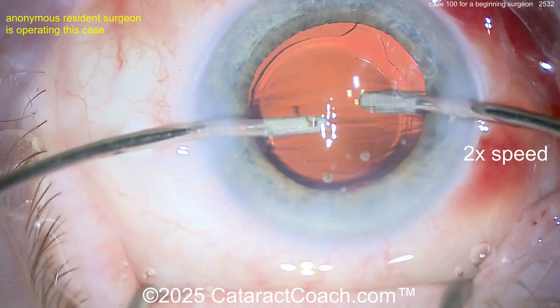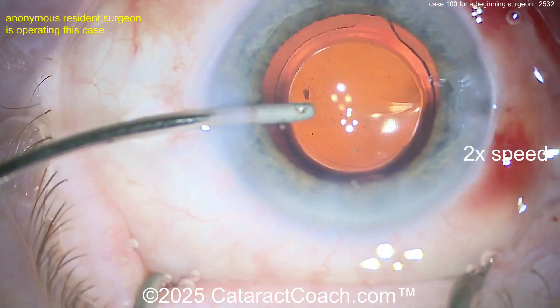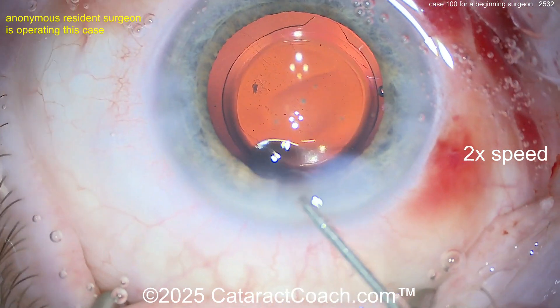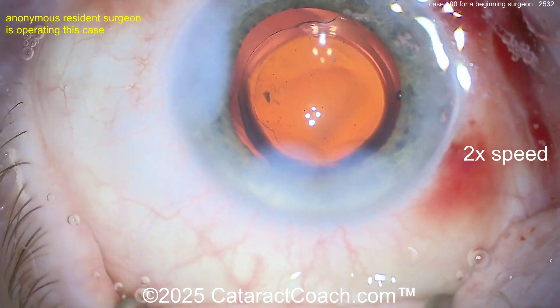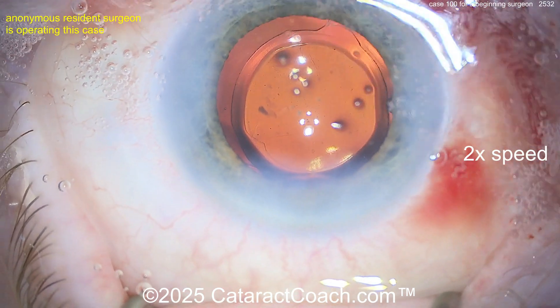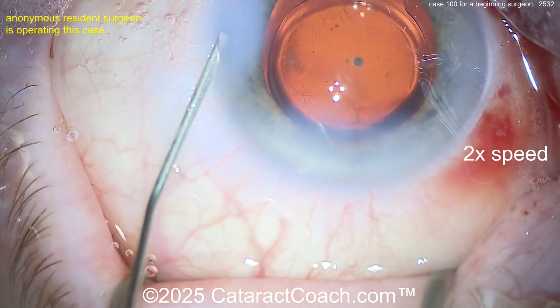You're a little bit afraid of going behind the optic when starting out, but you have to learn how to go behind the optic and remove viscoelastic — that's important. Put that on your list of things to learn. Now the end of the case, coming out of the eye, sealing up the incisions — a little bit of stromal hydration on the roof of the incision, that's not too bad. Sealing up the paracenteses — I think that's a bit much. Check all the incisions. I commend you — you did a good job, you're learning a lot. Keep up the good work, but certainly there are things to improve on.